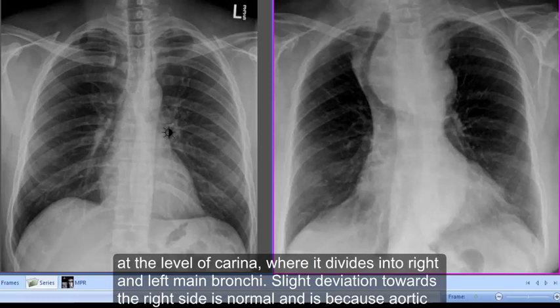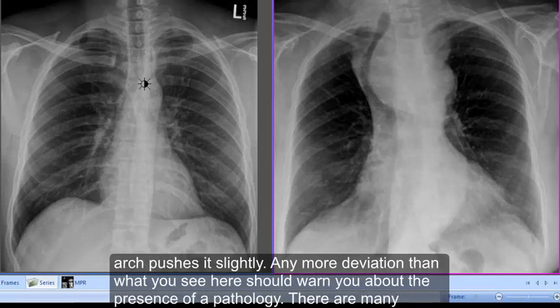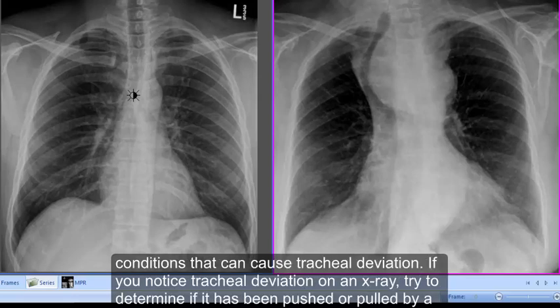Slight deviation towards the right side is normal and is because the aortic arch pushes it slightly. Any more deviation than what you see here should warn you about the presence of a pathology. There are many conditions that can cause tracheal deviation.